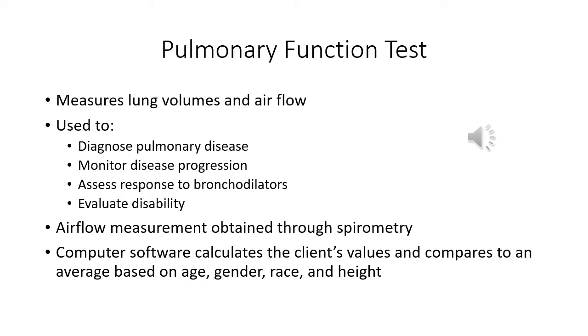This voiceover will cover diagnostic studies of the respiratory system. A pulmonary function test measures lung volumes and airflow. It is used to diagnose pulmonary disease, monitor disease progression, assess response to bronchodilators, and evaluate disability.